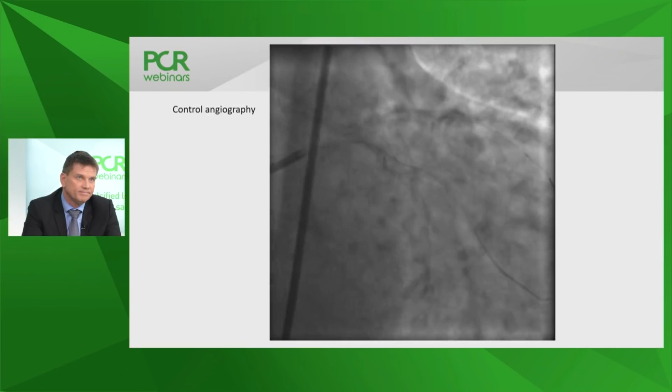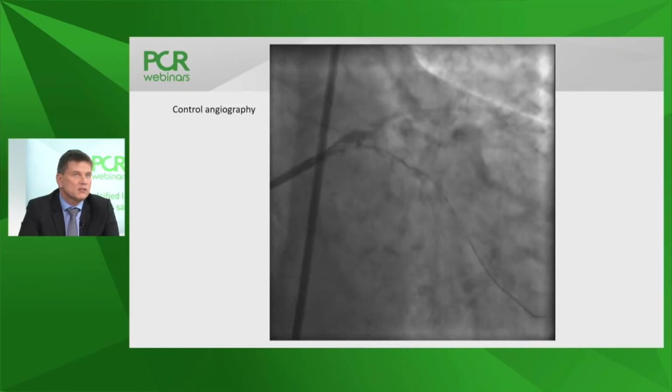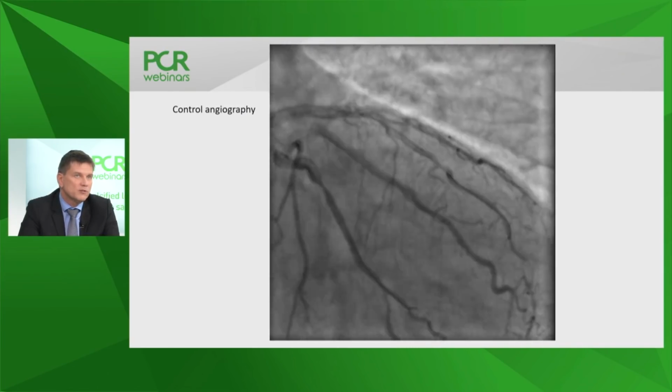How about doing an IVUS control here? After all, it's opened. He had the IVUS on the table. Wouldn't it be an option here instead of going further with balloons or just stopping? At least you would take a more informed decision. You know, we always say we want to know what is the question. And I think in such a complex disease, where you have a result which you say is very acceptable, but maybe you are not sure if you have the full expansion at the ostium of the LAD, to use the IVUS as a control to see if you have full stent apposition makes absolute sense.